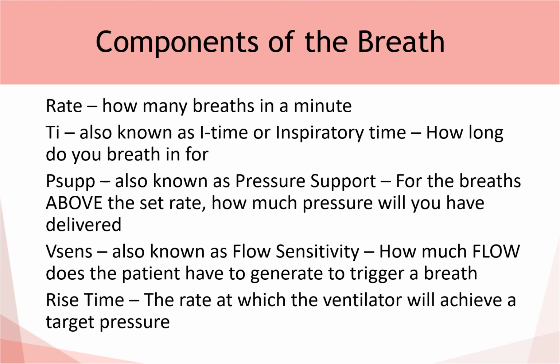How much flow does the patient have to pull through the ventilator to trigger a breath? Another way of thinking about it is how much air needs to move through that circuitry before the ventilator realizes the patient's trying to take a breath and helps provide one. And the last one is the rise time, the rate at which the ventilator will achieve the targeted pressure.